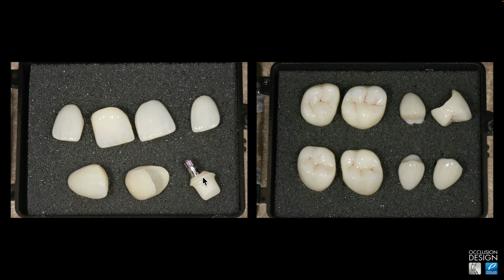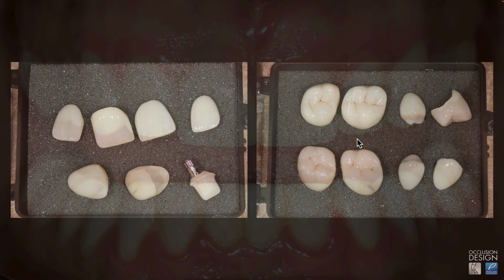So this is a zirconia custom abutment on a tie base with a zirconia crown. And then the rest of these anterior are feldspathic, layered feldspathic. And then, I believe, these 4 are Emax onlay veneers plus a jacket crown. And then these I know are full contour zirconia. So I think these are full contour Emax with some layering on the buccal. And then these are full contour zirconia for strength. So it's an interesting combination of materials.